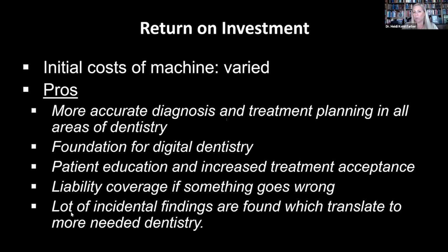And it's very similar to what we saw with medicine. So say, for example, if you have head trauma or anything like that, and you go into the hospital, they're going to take a head CT. It's just standard of care. If they didn't, they would be liable if you had a brain bleed or something like that. It's the same thing with dentistry. And really that gets pushed from the legal standpoint as far as what's a standard of care. We do say it's what the people around you have. But at this point, a lot of people have a CBCT. So if you don't have one, definitely something you're going to want to look into.